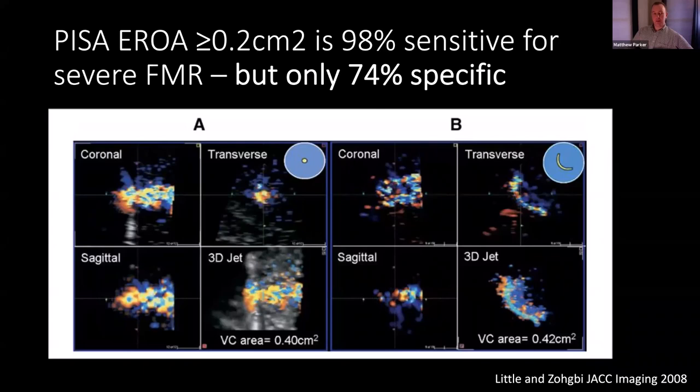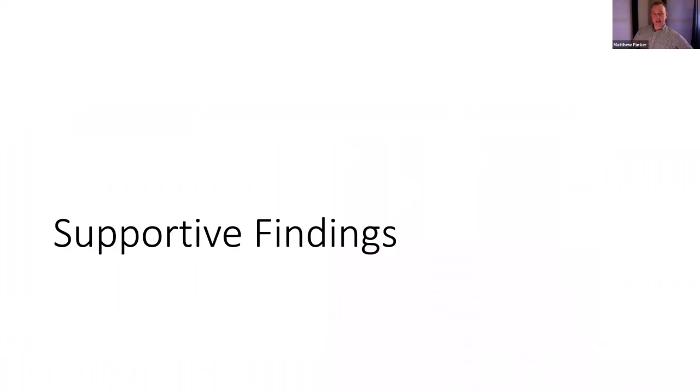You could just double it or have the threshold to adjust for that. But why make any more assumptions when you can just trace and know? So I think that is a really exciting advance. But after we've done all this tracing, how do we know that we're right? And also, when we're talking about just 40 millimeters, if I trace 41 millimeters, Jordy traces 38, Steve traces 45, and Lucy traces 35, how do we know who's right? Is it severe or not?